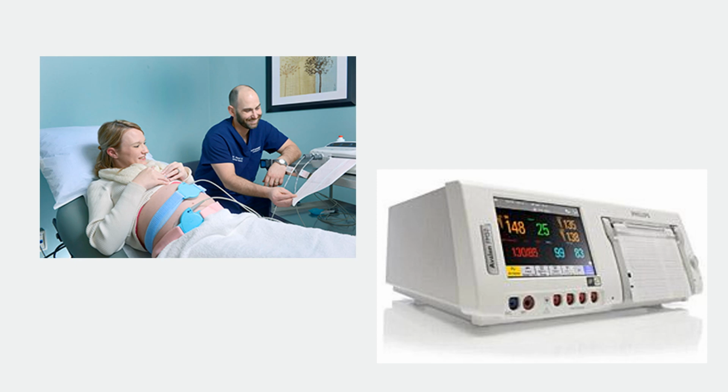So this is typically what we see when a patient comes in for evaluation. They may come in to be triaged, or they may come in to be induced, or they may come in in labor. And so in any case, we're going to put the fetal monitor on.